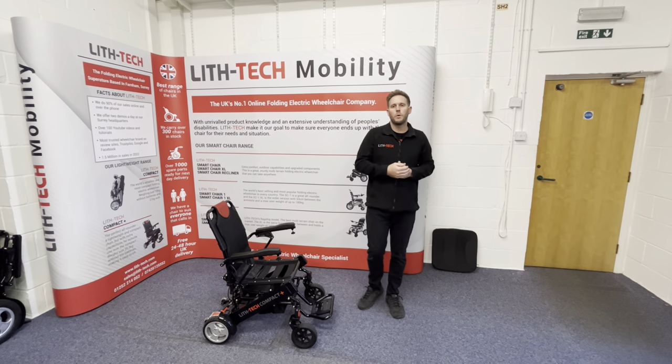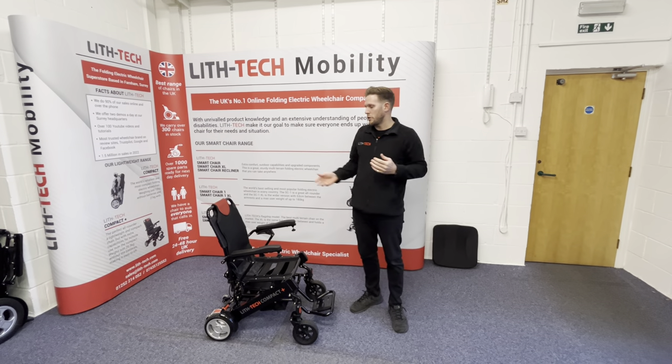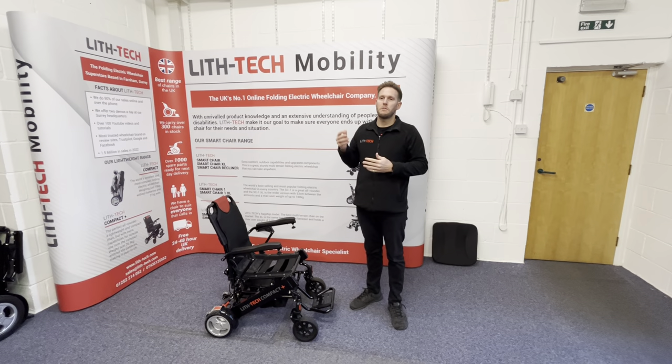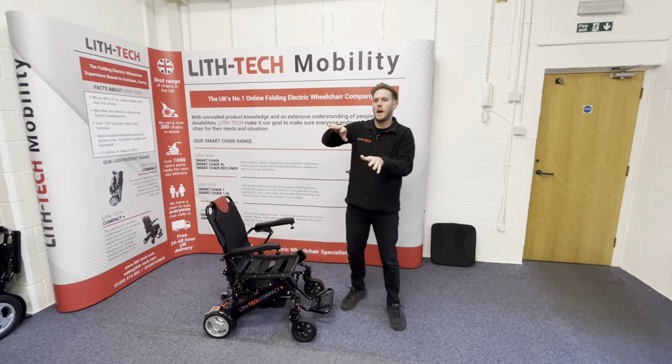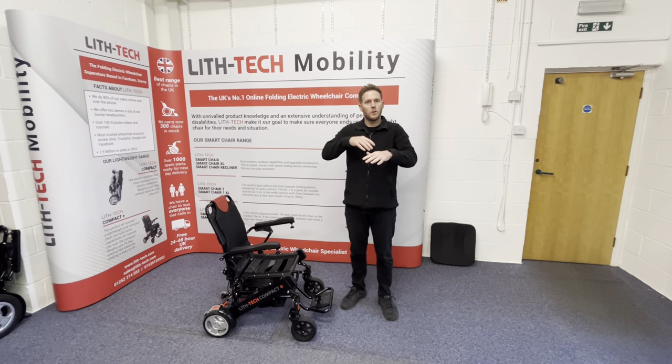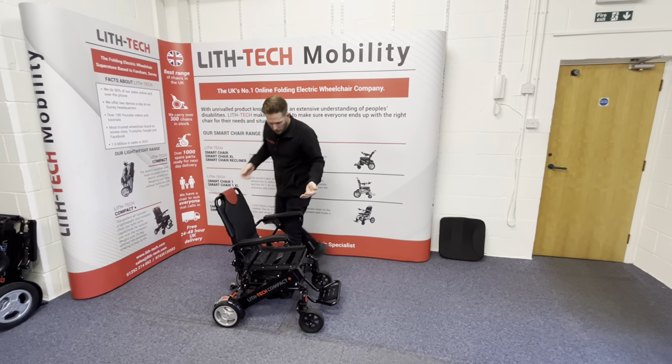When people now call us up and say they want our most capable lightweight chair, we can say that's easy — we'll give you the Compact Plus. It means you can get from home to town, go across pavements with cambers, go up and down curbs, over tree roots and things like that, but you can also still get it in your car.